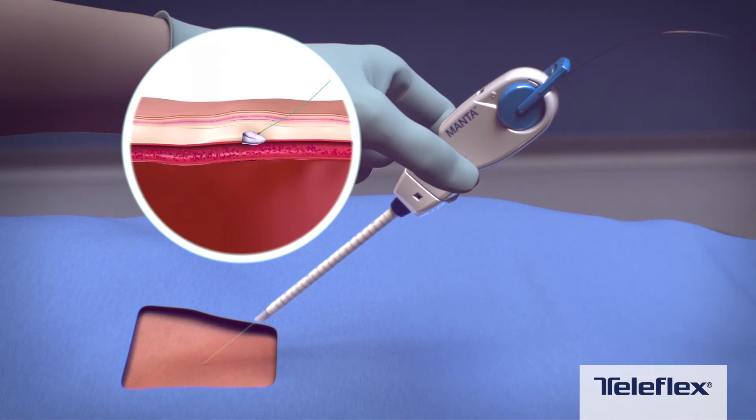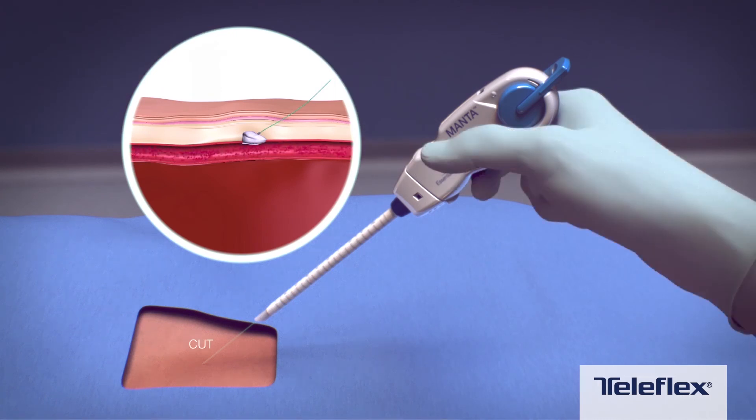Once hemostasis has been confirmed, remove the guide wire. The suture should be cut below skin level.